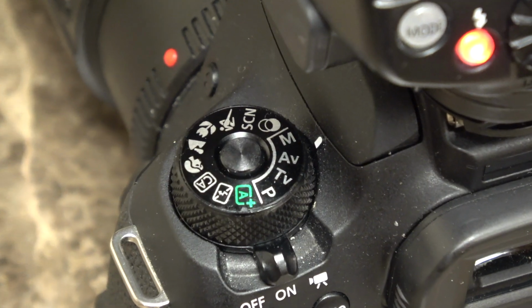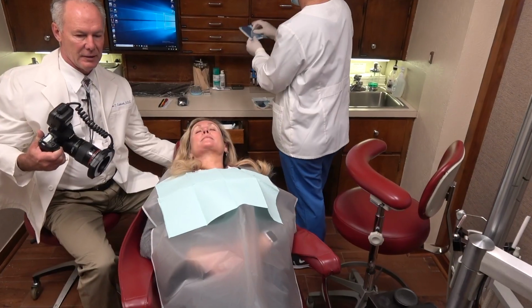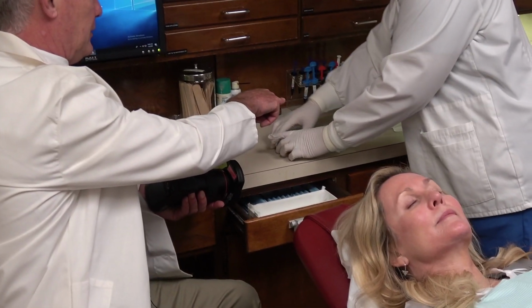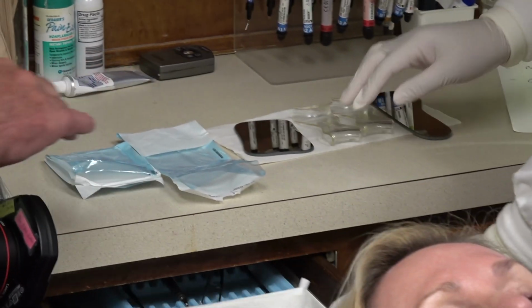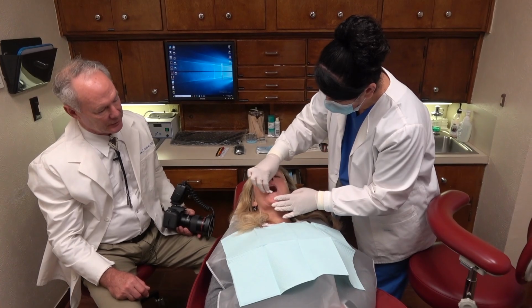Then I'm going to reset this button to M and this one to MF, manual. And it's very important that you have the right mirror system and retractors. So I like the single retractors right here. We put Vaseline on the retractors and on the patient's lips. Louisa is going to place Vaseline on the patient's lips.